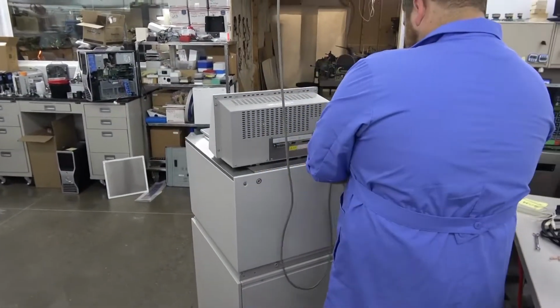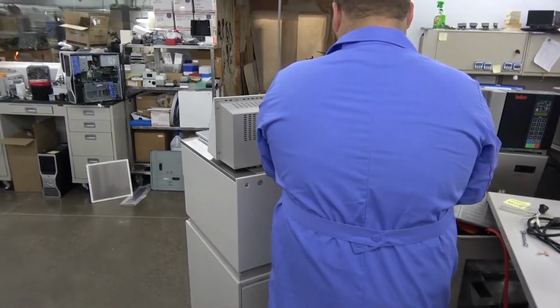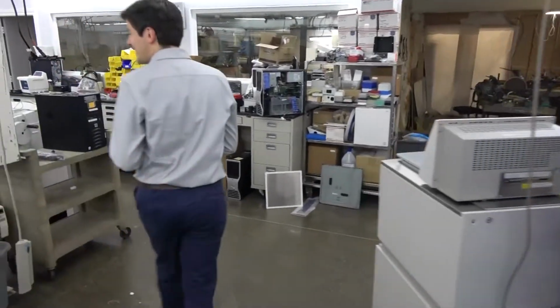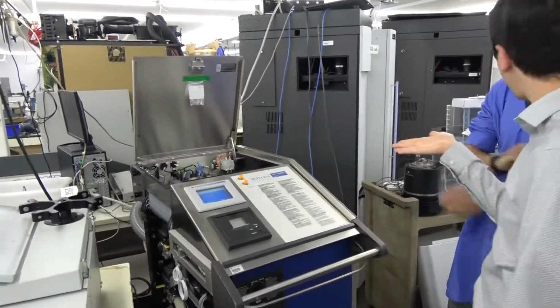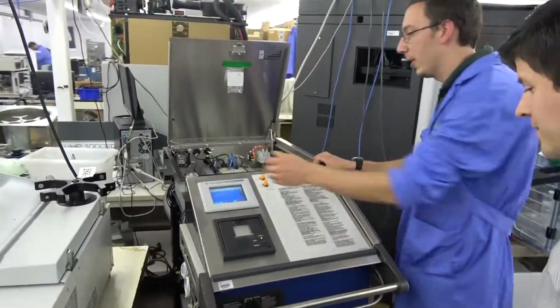Oh, so this is like a cliffhanger in a tech shop walkthrough. Okay, let's go. Ooh, this one's cool. Where's the scale? Isn't there normally a scale on the top? Did they change the location in this model?